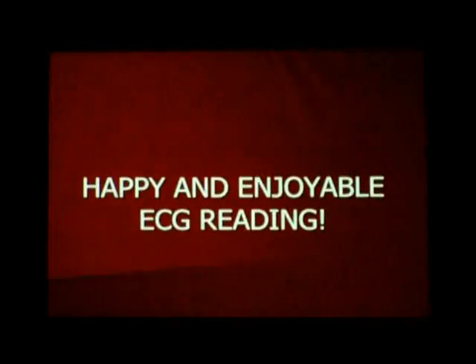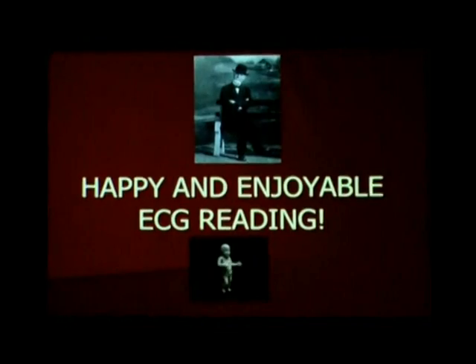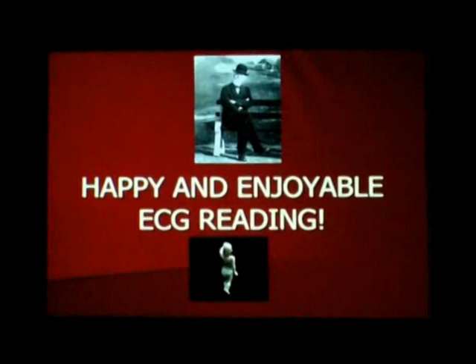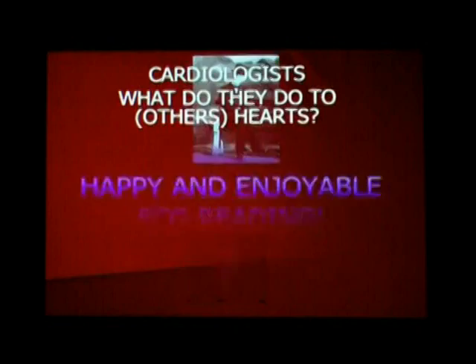An exciting journey begins today, and happy and enjoyable ECG reading. ECG reading is very enjoyable. When you try something, it's very enjoyable. For that we must give all our tributes to this man. Who is this man? He gave you the most cost-effective investigation in the world. ECG is the most cost-effective investigation. 75 to 100 rupees the patient pays. But see the amount of information and the life-saving treatment the patient is going to get. So that's why we give tribute to this man.